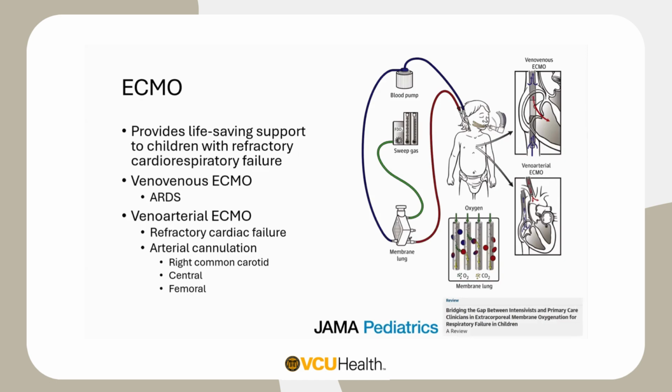So what is ECMO? It's extracorporeal membrane oxygenation. Here, we're trying to provide life-saving support to children who are experiencing refractory cardiorespiratory failure. We have two forms of doing this: veno-venous ECMO, or VV ECMO, and then veno-arterial ECMO.